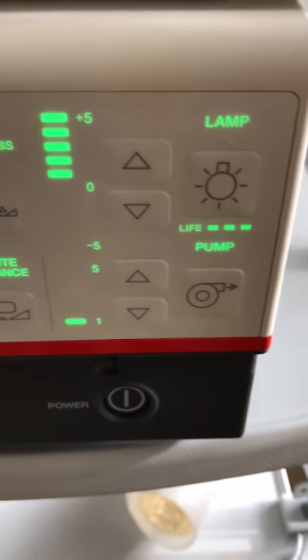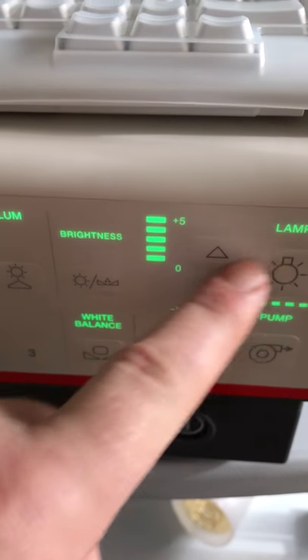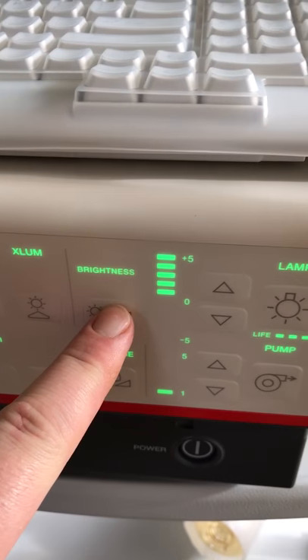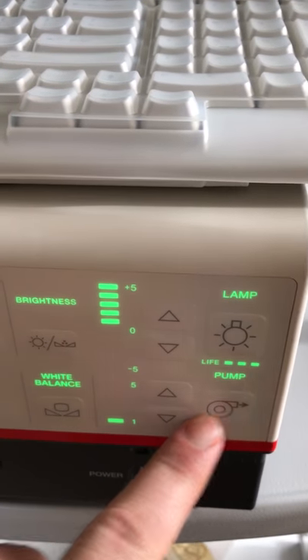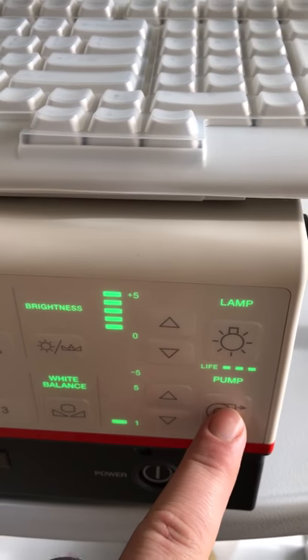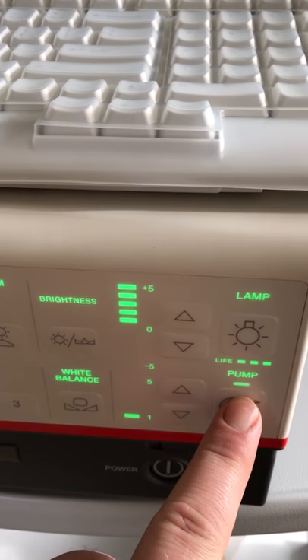Down here we've got the lamp to change the brightness. We can also change the redness and the blueness. Up and down we've got our white balance — white balance is very important, always do a white balance.